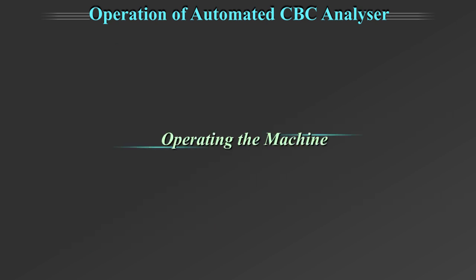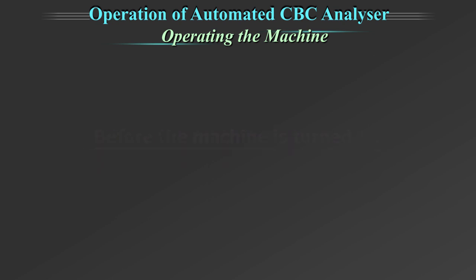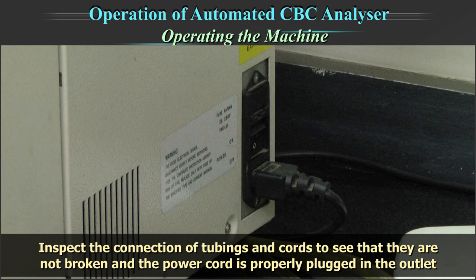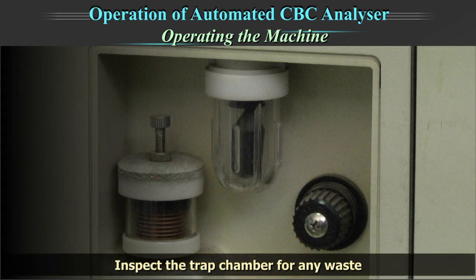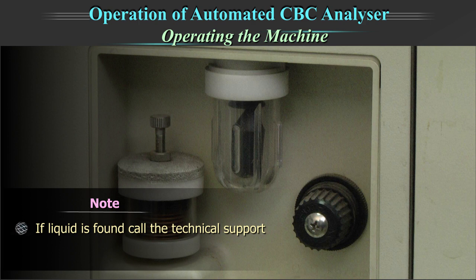Before the machine is turned on, inspect the reagents and inspect the connection of tubings and cords to ensure they are not broken and the power cord is properly plugged in. Inspect the trap chamber for any waste. The trap chamber indicates the hydraulic and vacuum status of the equipment and should have no fluid in it. If fluid is found, call technical support. Do not open the trap chamber.